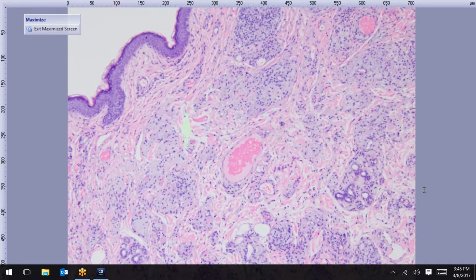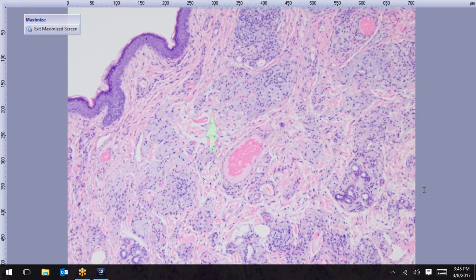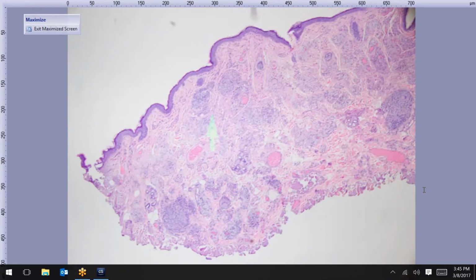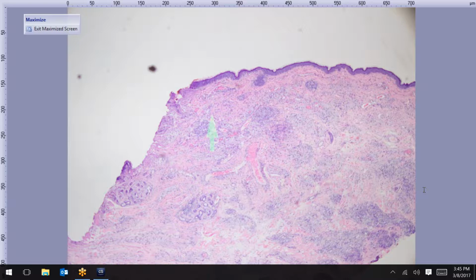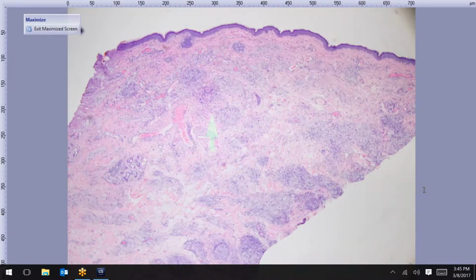You see this collagen isn't so densely packed like it is, for instance, in the back or something like that. So it's really just thin skin and loose stroma. And those are the main things that would differentiate that. But you can't always definitively say, hey, this is from the eyelid, but those are some clues.